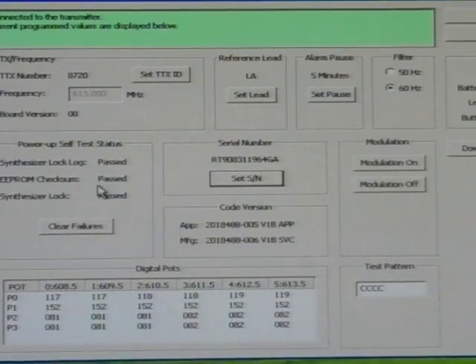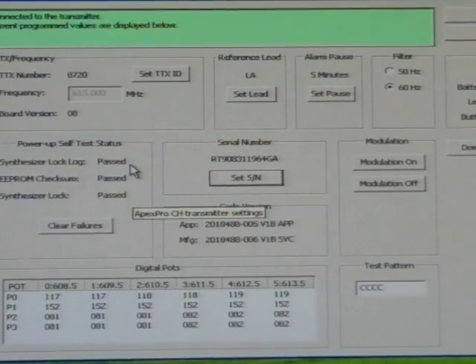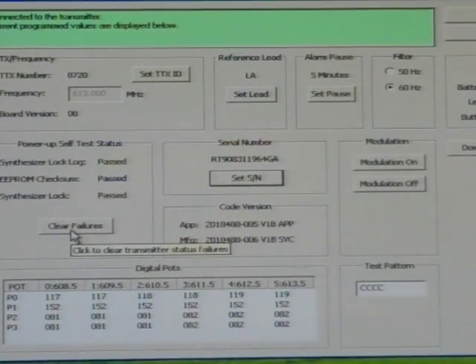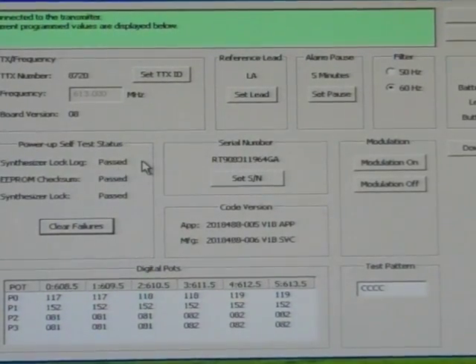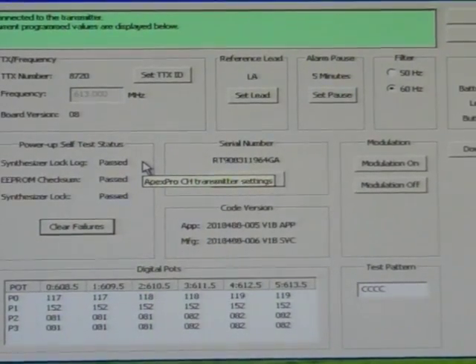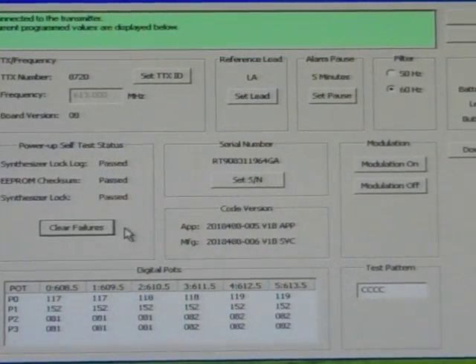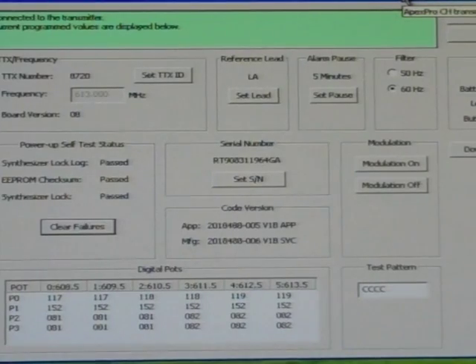On your serial number, if you ever have a need to change that serial number, you can do that there. And on your clear failures, if any of your self-tests pop up a fail, before you would send that into service, my recommendation is to try to clear those out yourself. So you'd press your clear failures. Sometimes it works, sometimes it doesn't. If it remains a fail, you have more issues, and probably sending it in for service is a good idea. But if not, and you've cleared it, then this programming kit has paid off for you. No service at this time.